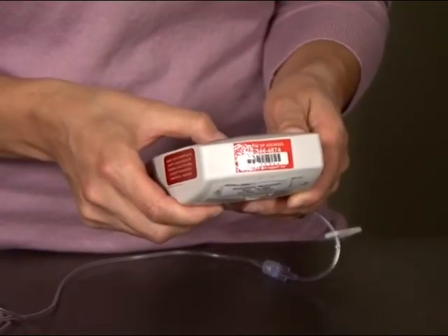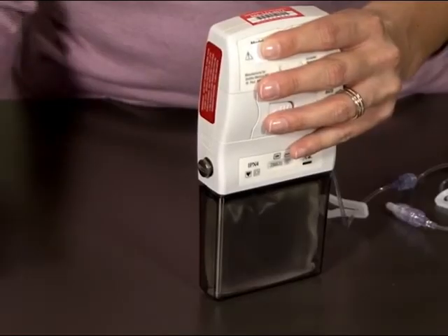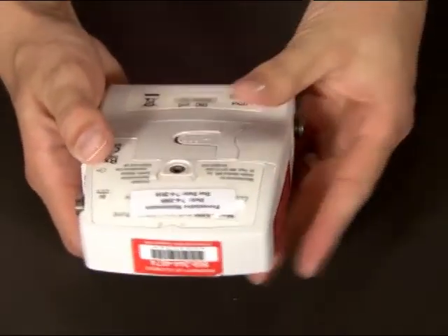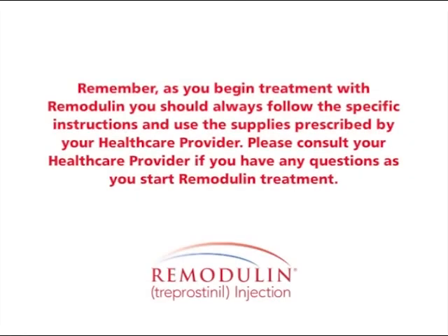To store your pump, first stop it by pressing and holding the start/stop button until a series of lines appears. Next, turn the pump off by pressing the on/off button until the lines appear again. Using a coin, remove the cassette from the pump. Discard the cassette and the tubing. If it's your day to change the pump batteries, go ahead and change them. Once you've installed the new batteries, you can store the pump. Remember, as you begin treatment with Remodulin, you should always follow the specific instructions and use the supplies prescribed by your healthcare provider. Please consult your healthcare provider if you have any questions as you start Remodulin treatment.